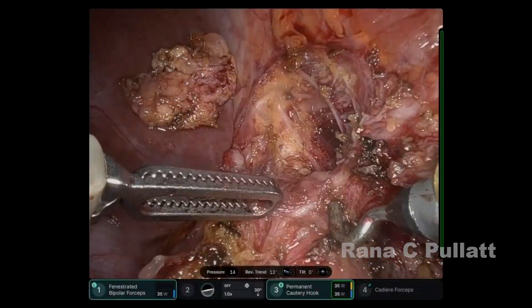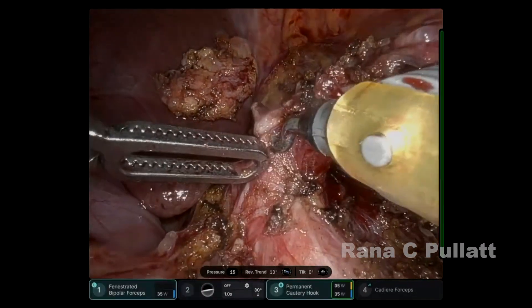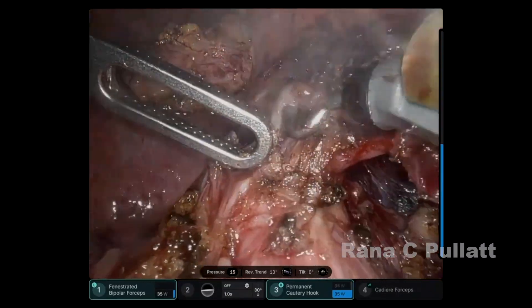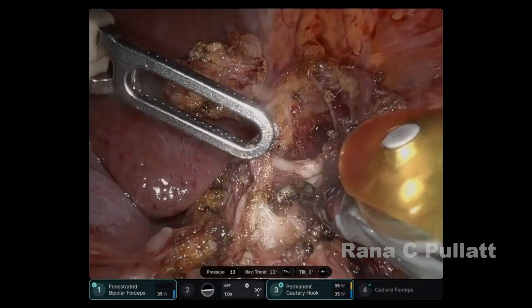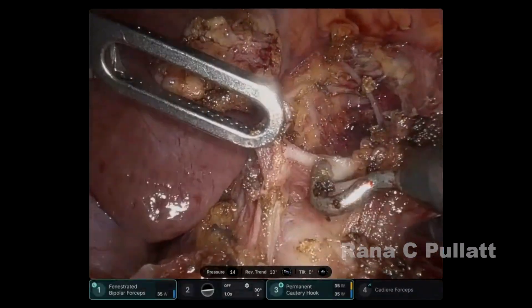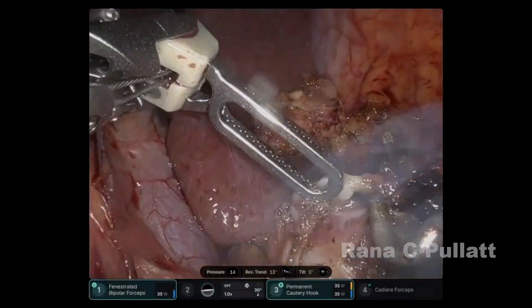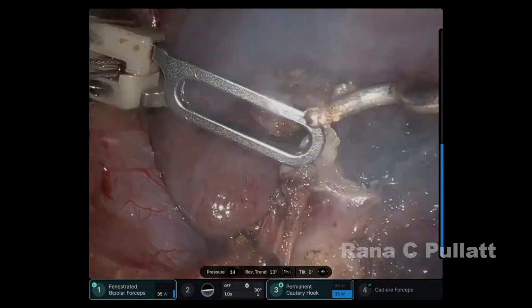The left gastric vein is then ligated. The celiac artery and left gastric artery bases are identified. The tentacles of the celiac ganglion and the nerve fibers are all taken down using the hook. Of note, this operation would definitely benefit from a protected hook; however, there is no such option on the robot to have a protected hook.